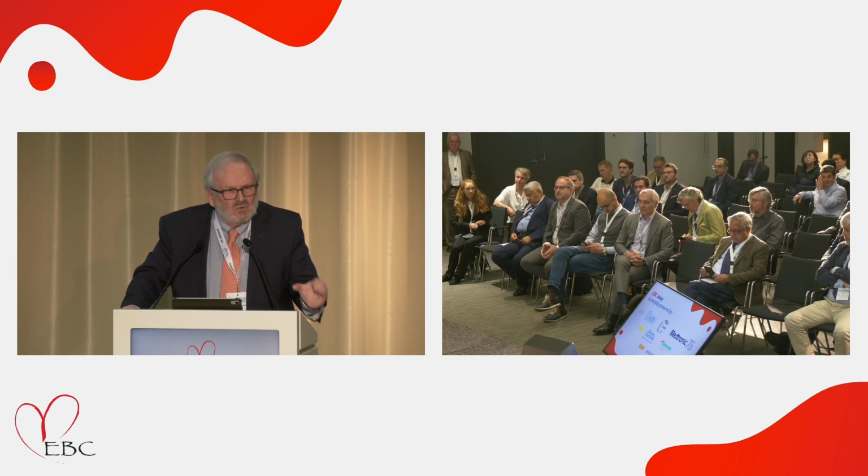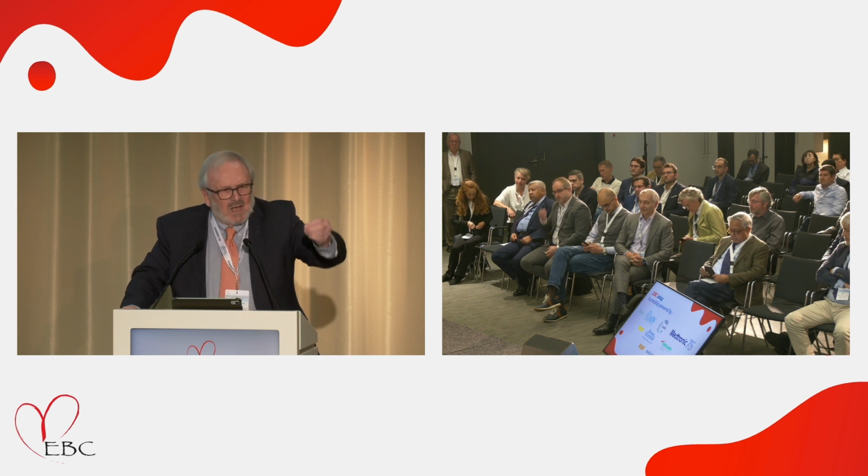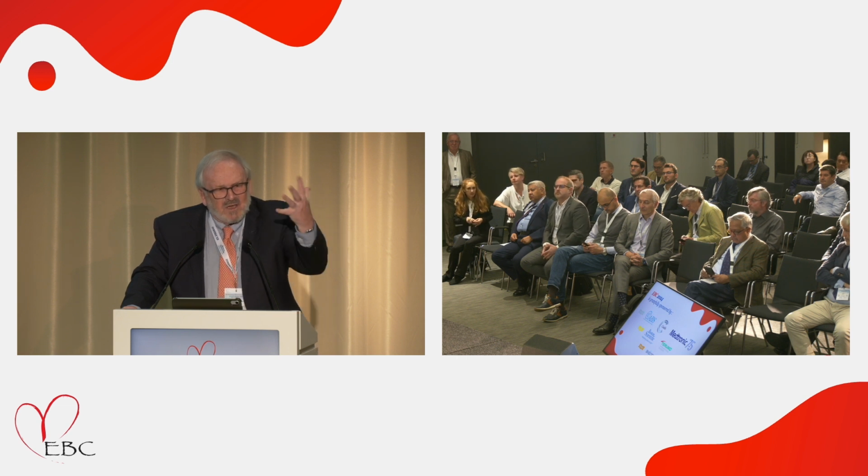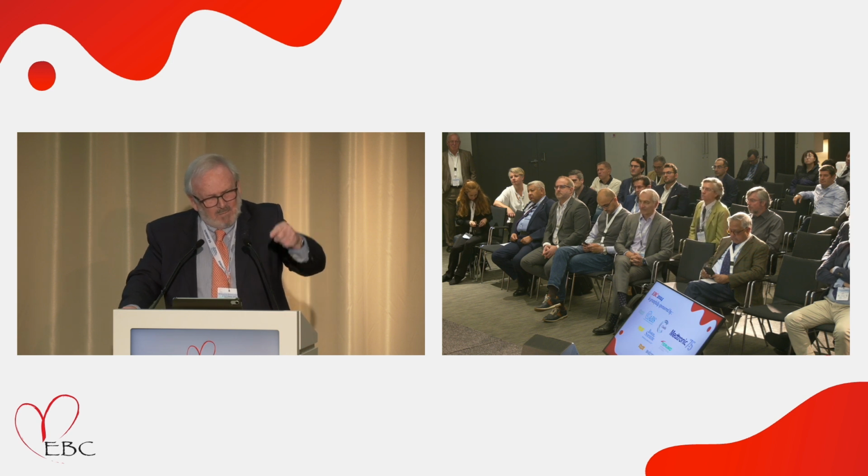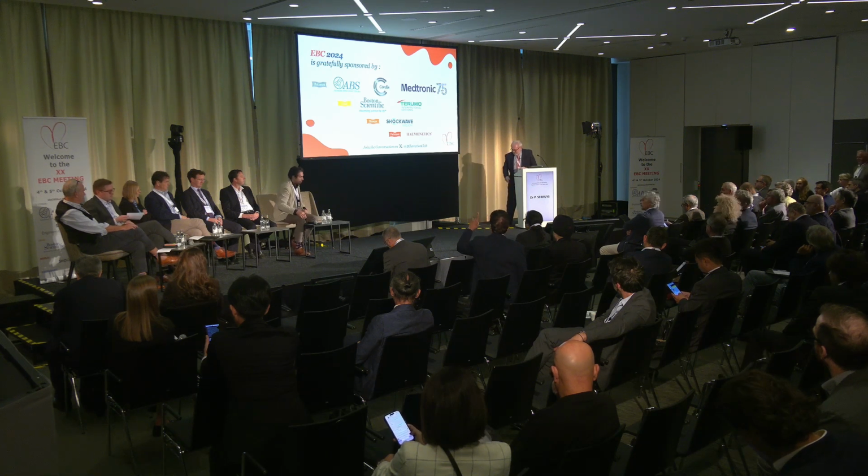And then we have to use the delta. The ICFA, this group, has put as the first important things, the 5 features which are important: the delta FFR-CT, then the plaque burden, then the total volume, then the low attenuation volume, and then the LV myocardial flow, which will be commercialized early 2025. Yeah? Okay.